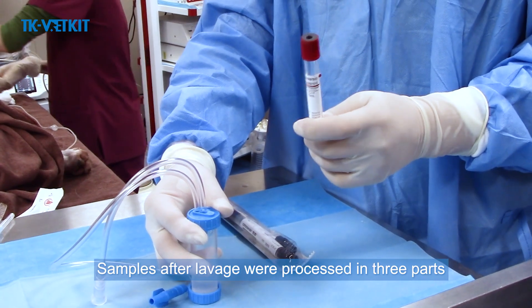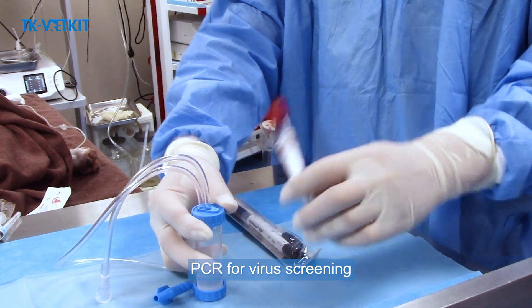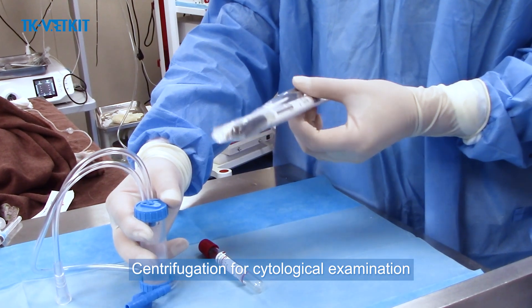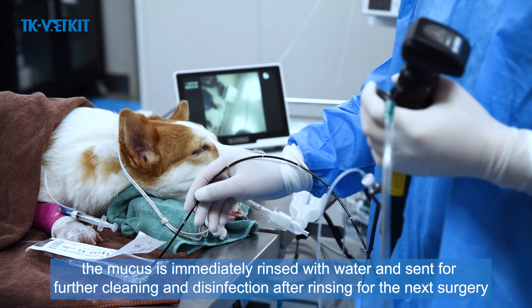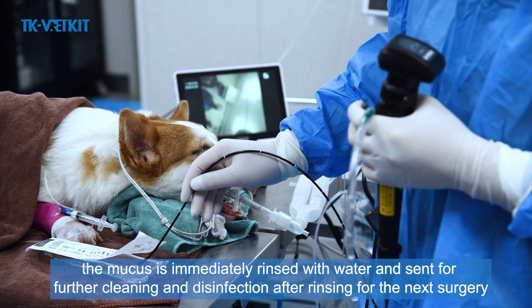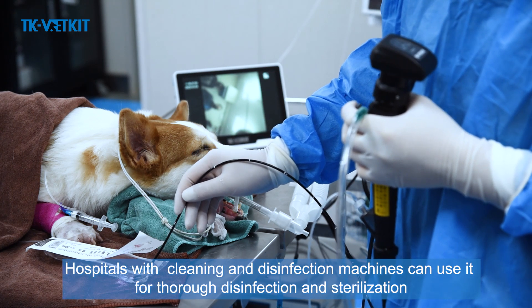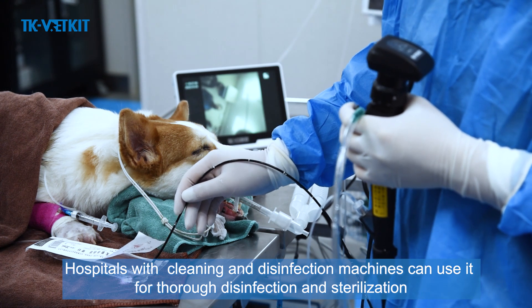Samples after lavage are processed in three parts: PCR for virus screening, bacterial drug sensitivity testing, and centrifugation for cytological examination. After the endoscope is used, mucus is immediately rinsed with water and sent for further cleaning and disinfection. Hospitals with cleaning and disinfection machines can use them for thorough disinfection and sterilization.